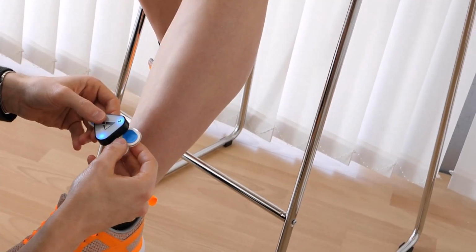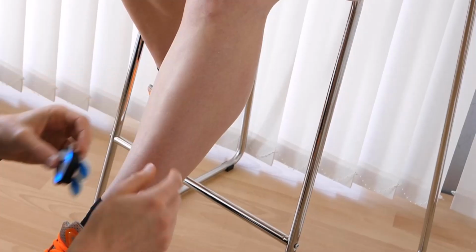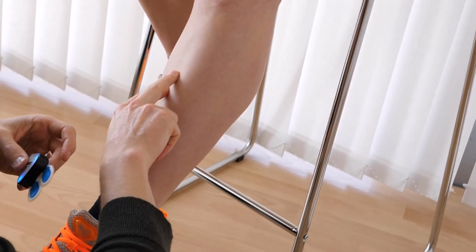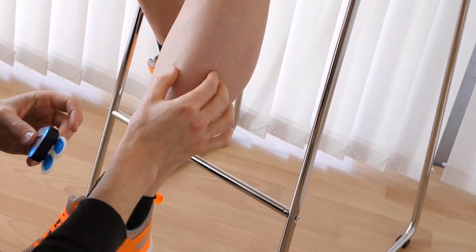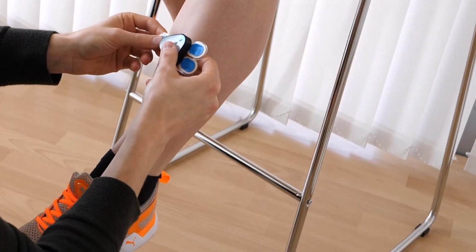Tibialis anterior is a muscle where we don't need extension cables because we have a bony structure right next to the muscle, which you can easily use as a reference. If we are measuring a larger muscle, we need a reference electrode on a bony point and use the extension leads accordingly.